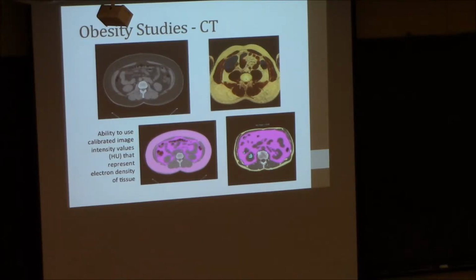But one of the first things that years ago, researchers would come to me and say, how do I know how fat somebody is? You can measure their girth, but it doesn't tell you the whole story. This is work we did years ago. This is a cut through a real person, about at L4-5, the lower lumbar region. There's a lot of fat, which we call sub-Q fat, on the outside, and then these are the abdominal muscles, the abs and the lateral abdominal muscles, and the back muscles, the psoas muscle. And this is just fat and gut, basically, in the middle at that level.